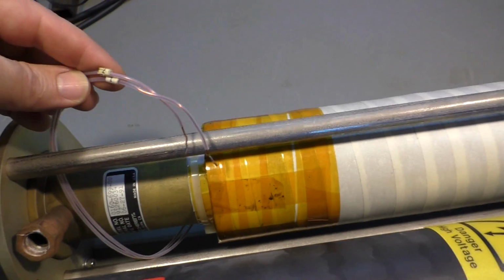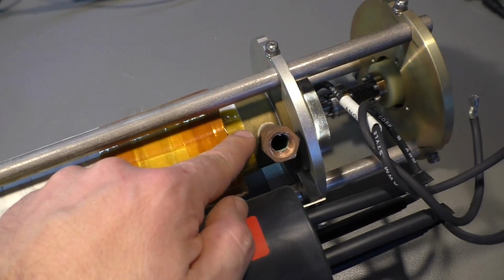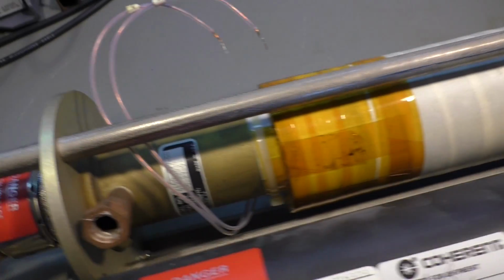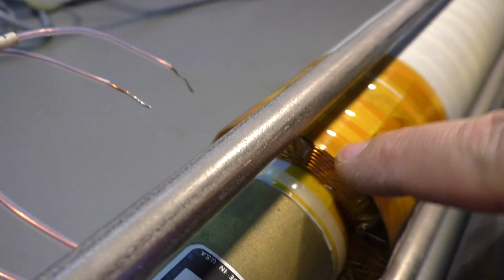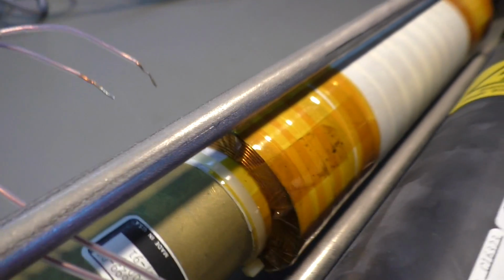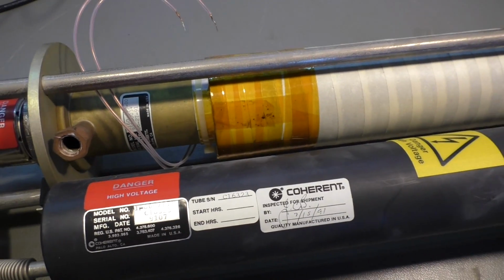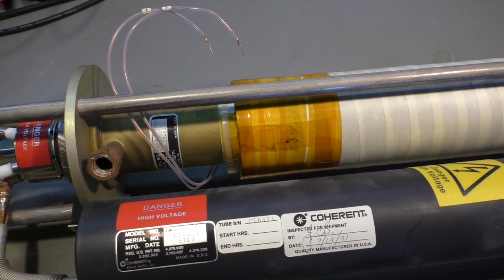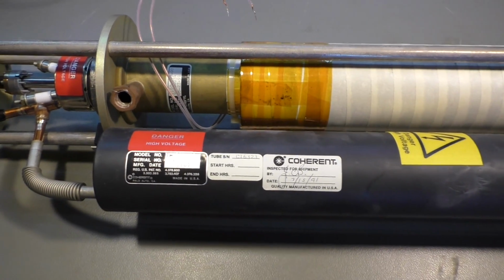We have an electromagnetic coil here along the tube. It's a copper winding. You can see it here. It goes all along the tube. I think that's to narrow the electric discharge inside the tube to a smaller diameter.